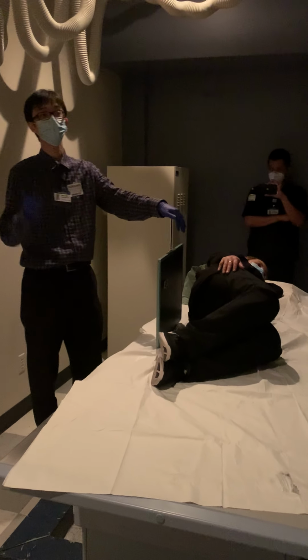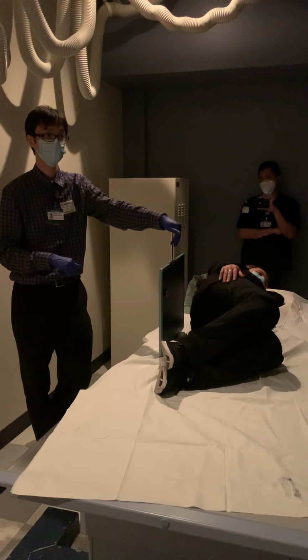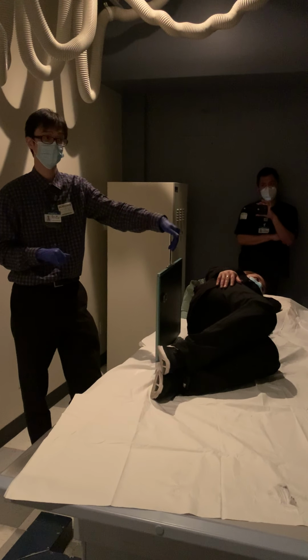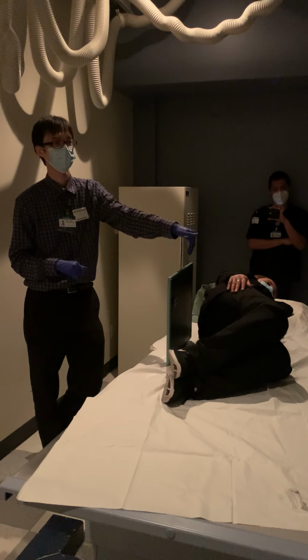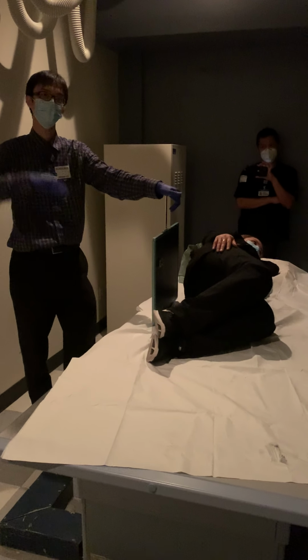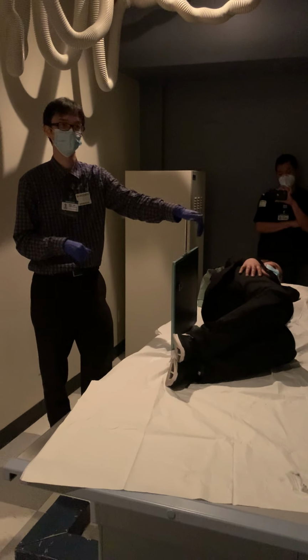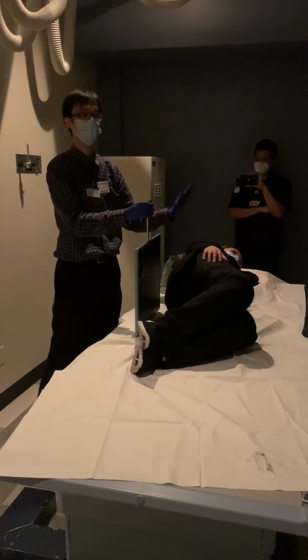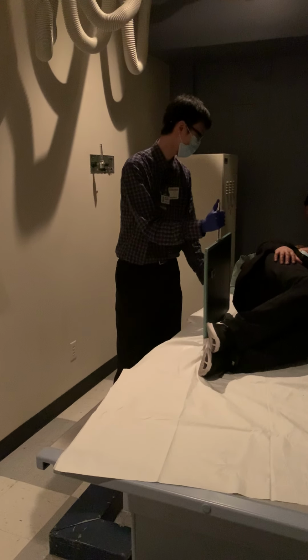If you did a right lateral decubitus, what organ is going to be up? So the left side is up. What organ is on the left side? The stomach. What's inside the stomach? Air. So stomach air, free air, they overlap. It's hard to put them apart, right? It gets obscured. So we do prefer left lateral decubitus when it comes to free air.